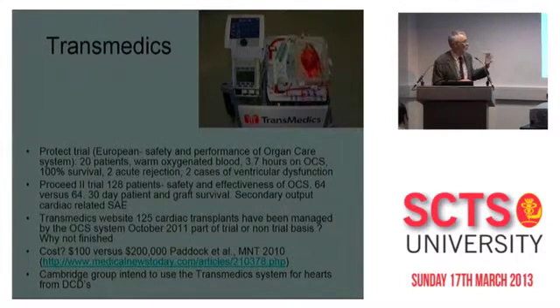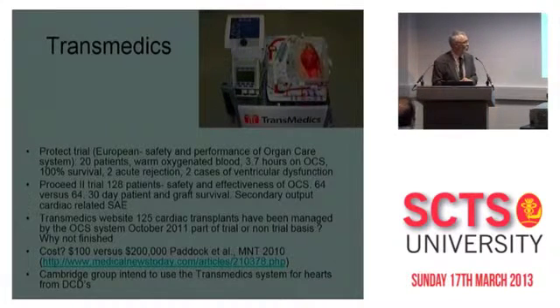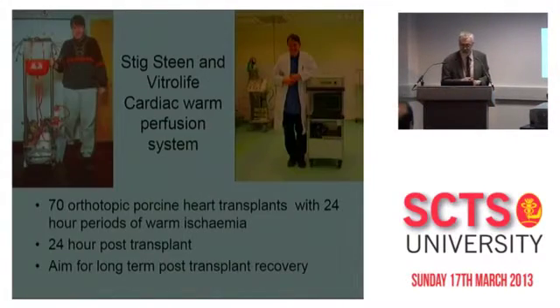Why hasn't it finished? Well, obviously, cost must be an issue. I don't fully know about this, but there was a publication by Paddock reckoning the difference was between $100 and $200,000. I think that probably is a bit of an exaggeration, but it probably takes in the developmental costs. The Cambridge group, using the DCD donor hearts, are aiming to use the Transmedics for their hearts.